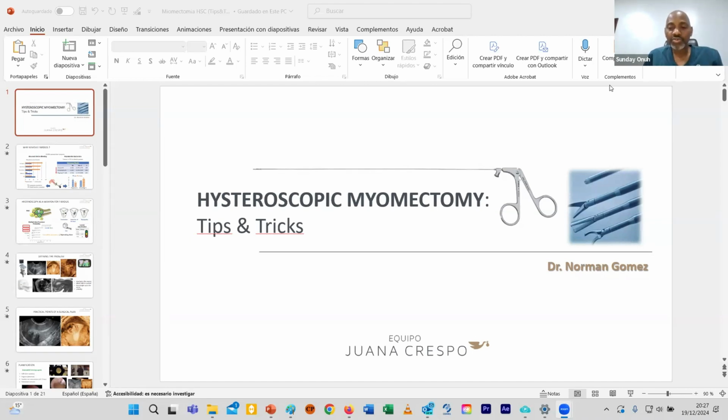Final question here before Rice will talk. Do you usually do a second look hysteroscopy after your myomectomy? And if you do, how long after the myomectomy do you go in for a second look? Perfect. So yes, if we perform very aggressive surgery, aggressive meaning a lot of fibroids, more than 2 fibroids, I suggest doing a second look.